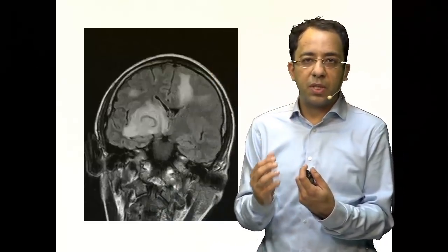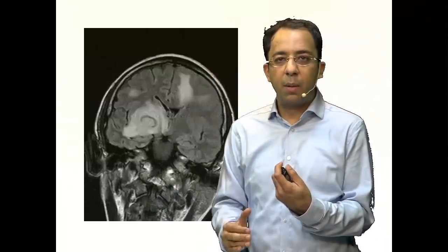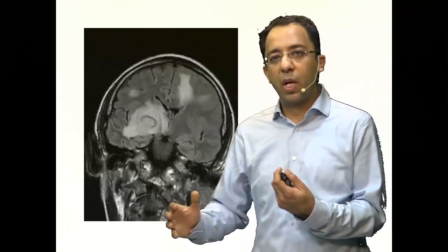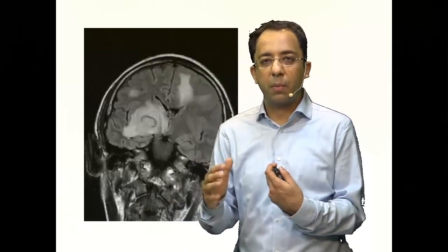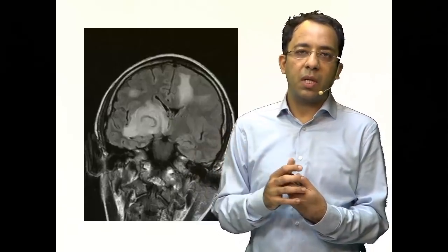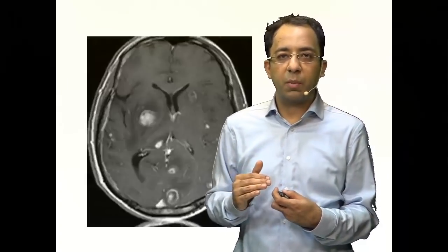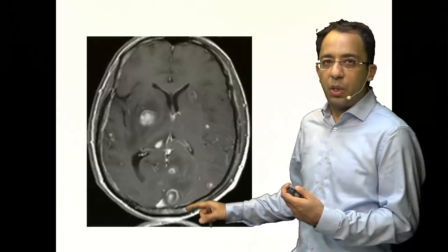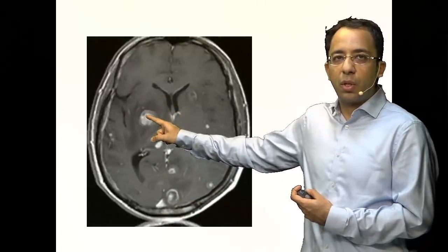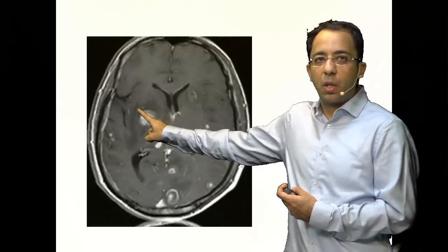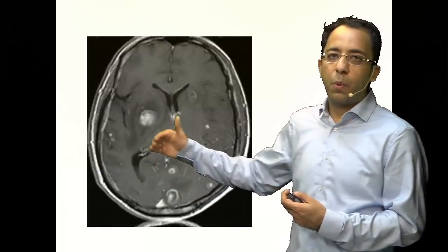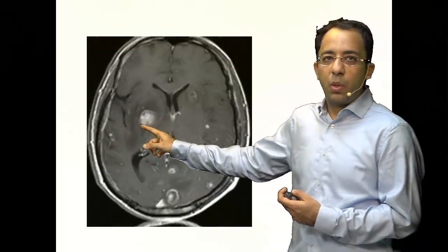Enhancement seen in a brain lesion indicates two things: vascularity and disruption of the blood-brain barrier. Both are typically seen in an inflammatory lesion. When IV contrast is given, all those areas where we saw edema are confirmed on the T1 post-gadolinium image.